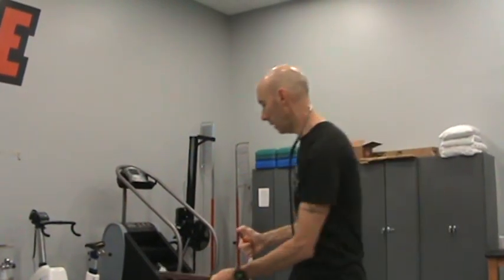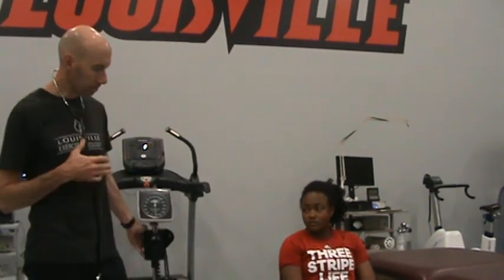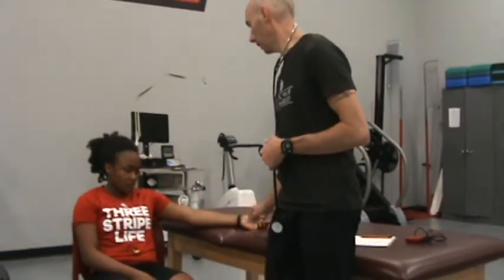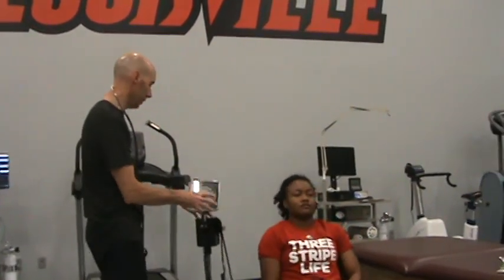So I have her seated now. Again, I'm going to go ahead and now measure her blood pressure from the seated position. I'm going to stay on her right side again. Now notice now her arm is not supported on the table. So there's a couple options I could have. If she was on the other side of the exam table, I could have her just sort of rest her arm here. Okay, that way it's still supported at heart level, but since she's on this side of the table, I'm gonna manually support her arm myself. So I'll show you how to do that here in just a second.